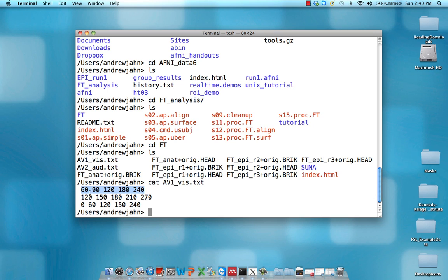So at 60 seconds, 90 seconds, 120 seconds, 180 seconds, 240 seconds in the first run, we had visual stimuli being presented. Then in the second run, the first time that we see visual stimulus is at 120 seconds, and then 150 seconds, and so on.